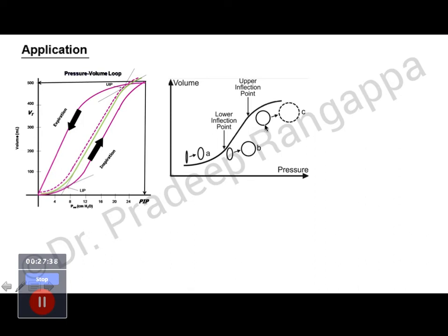And this remains the same over a certain time and it peaks here, and after that if you continue to increase the number, then it leads to barotrauma. So the whole range between the lower inflection point and the upper inflection point is the optimal PEEP, and that is indicated by the x-axis. You see the numbers that will tell you. If you have a number of say 12 here, then 14 is your ideal PEEP, and then you have to titrate it to the patient.